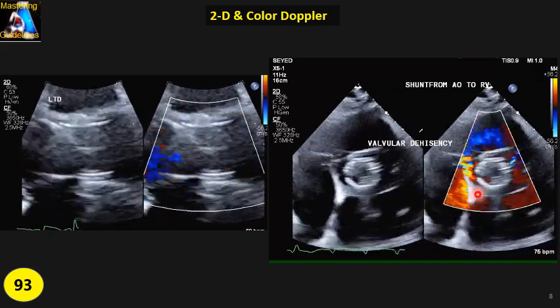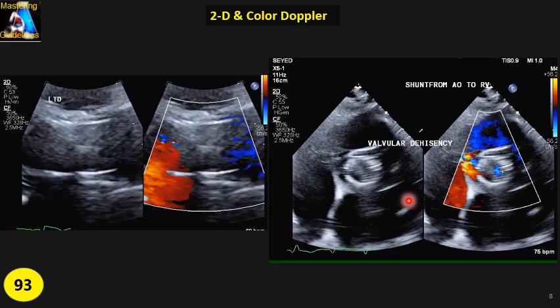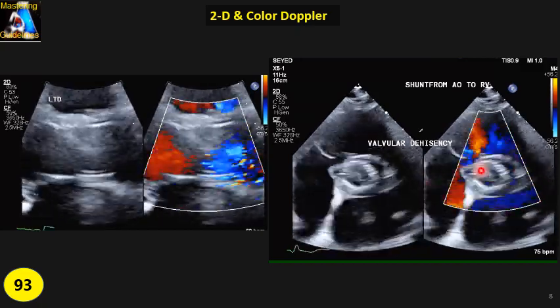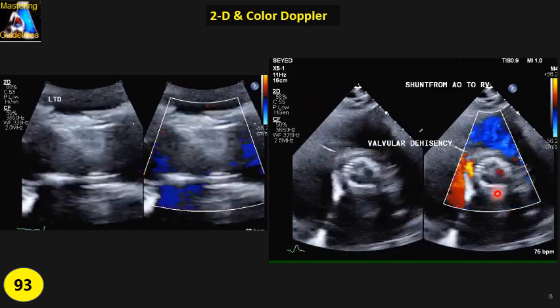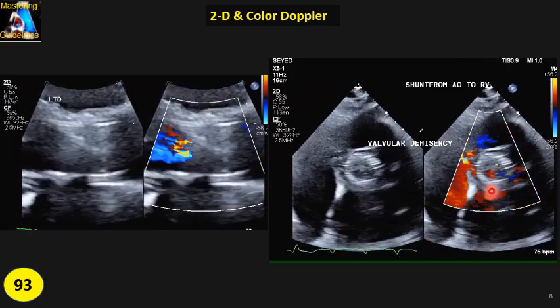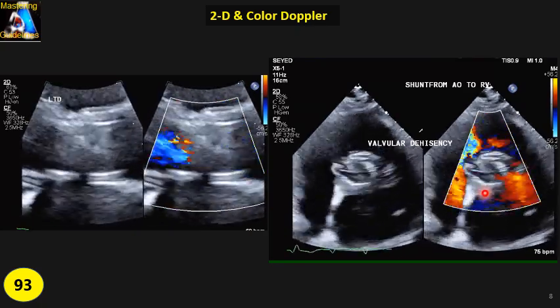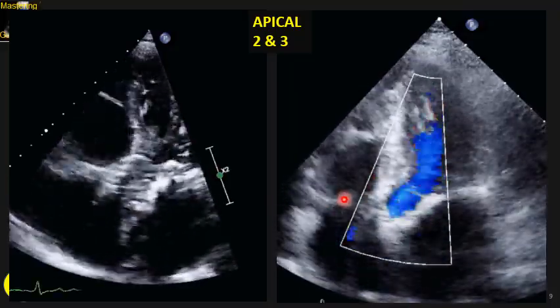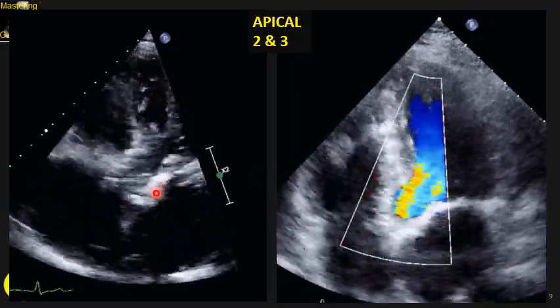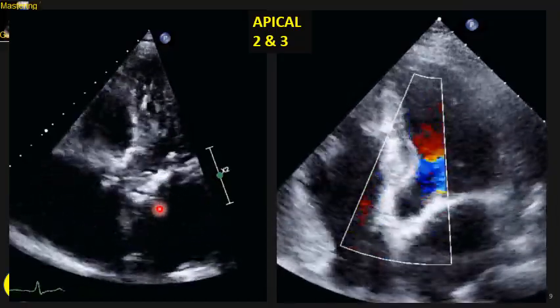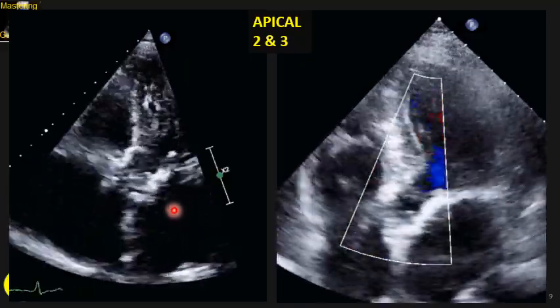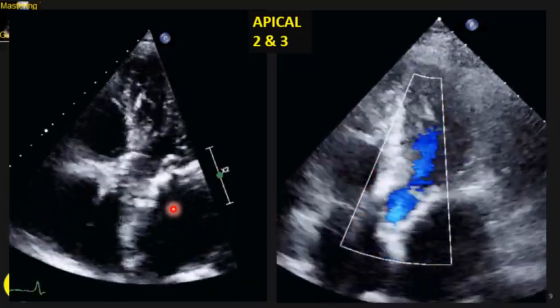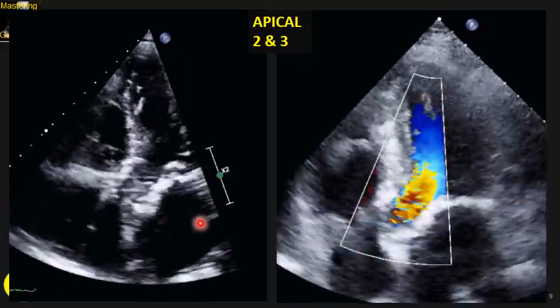For PSAX, remember the valve has a height, so you must evaluate at three levels: top, middle, and bottom. Slide from the top down through the middle to the bottom, checking with color Doppler for any abnormal blood flow at each level. Repeat the same technique on apical five and apical three. On apical five, tilt the probe tip up and down slowly to check for abnormal flow. On apical three, fan toward the left and right shoulder of the patient and make sure there is no abnormal flow.